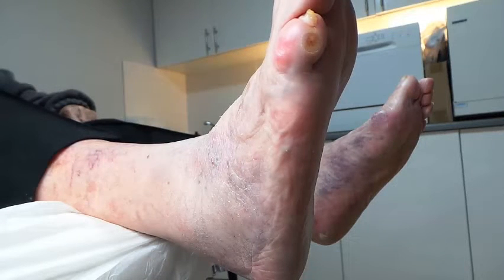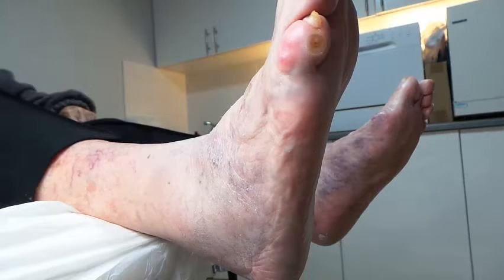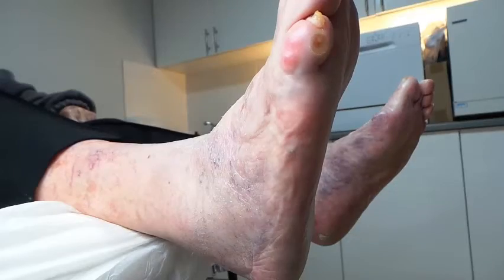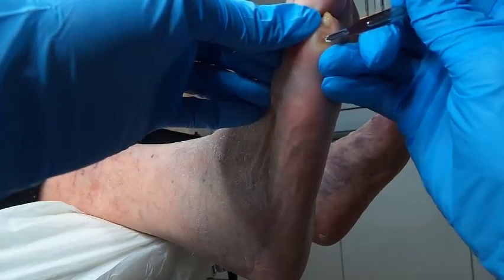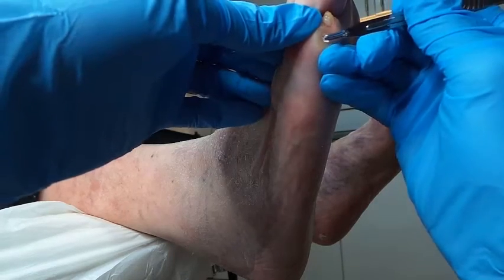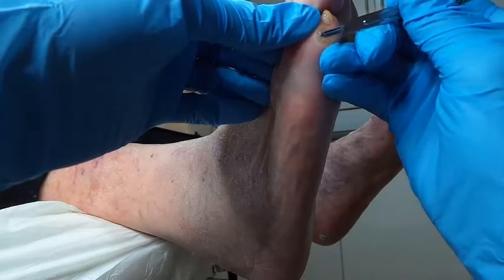Let's see what blade do I need — I'll use a two blade to get rid of that. Oh, this is a three. Okay, fine, a three is fine, just to get this bit out. Is that really sore? Yeah, it's a bit tender. Sorry. It's alright, you just carry on.